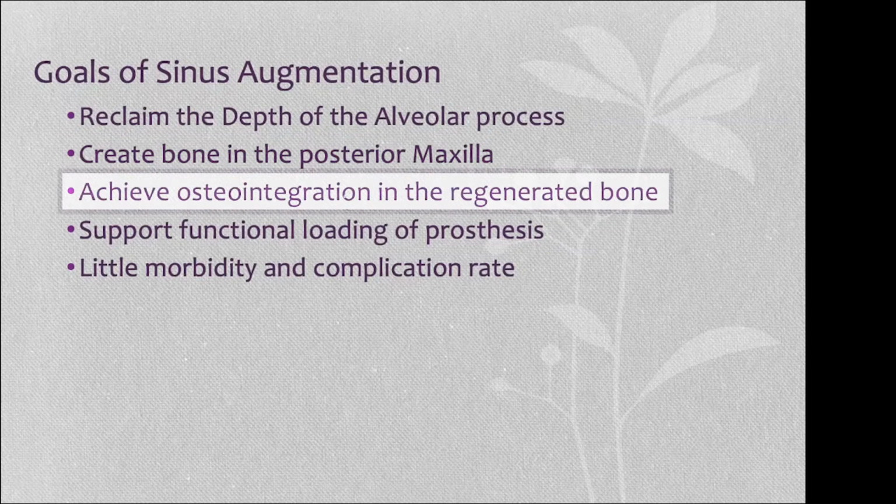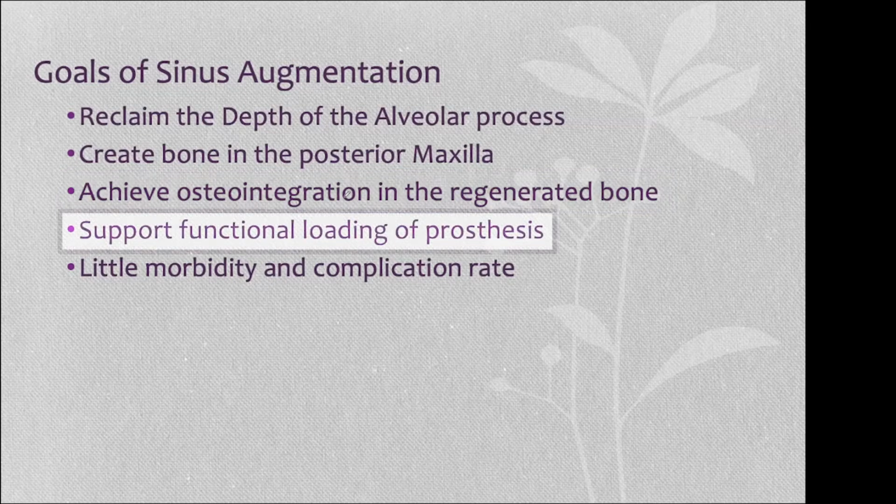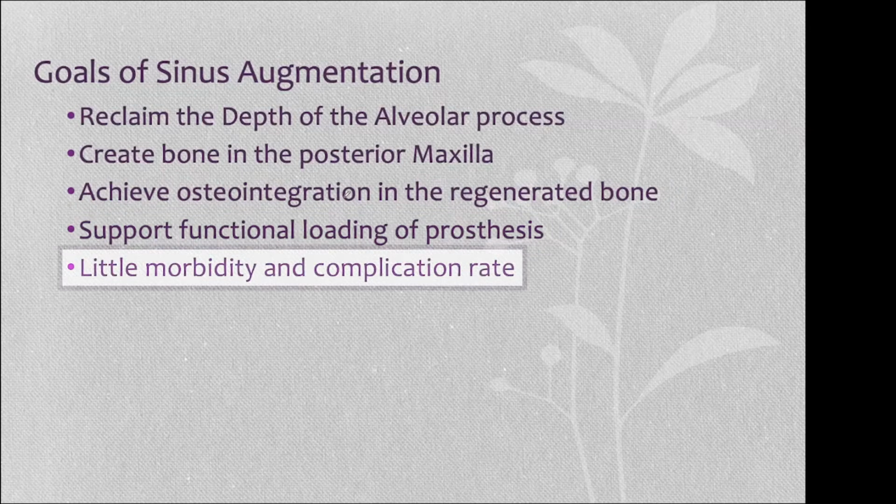And obviously, after what I've just told you, it's not that hard if you get a modicum of stability of the implant and you encase it in a SynthoGraft slurry, or mud if you will, that has been well mixed with the patient's own blood. Now, our ultimate goal is to get the support for a functional loading of the prosthesis with as little morbidity and complication rate as possible.